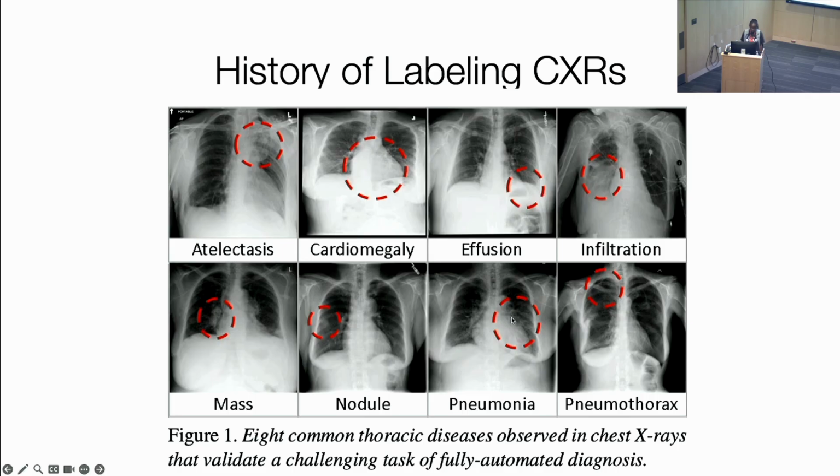And you can see I'm interpreting them from some of the language that radiologists use. You can have a mass, which tends to lean towards a cancer or something like that. You can have a nodule, and the difference between these two is usually size, when you call one a mass or a nodule.